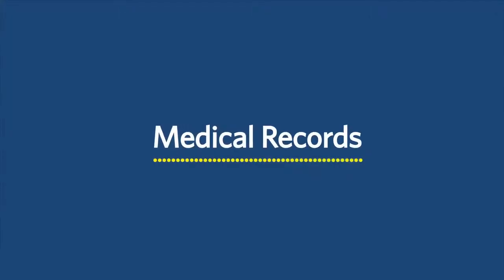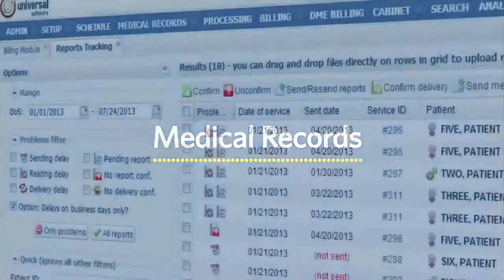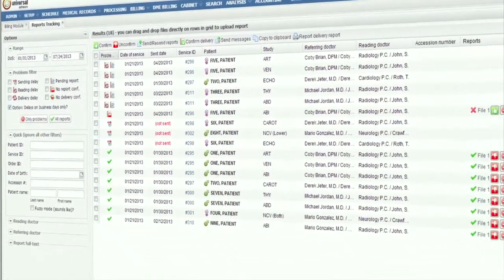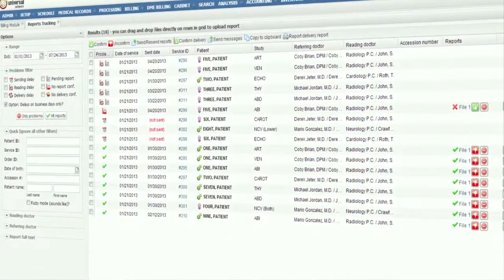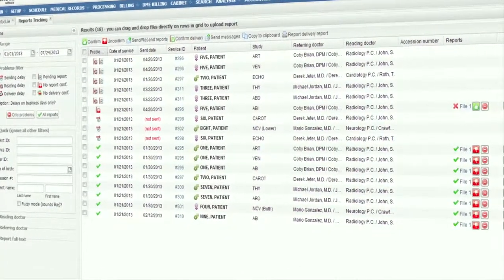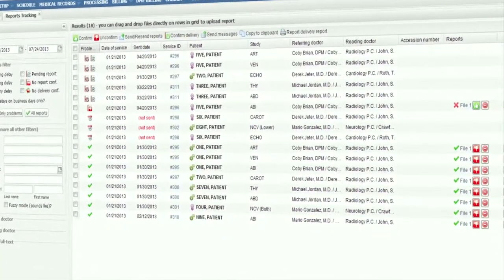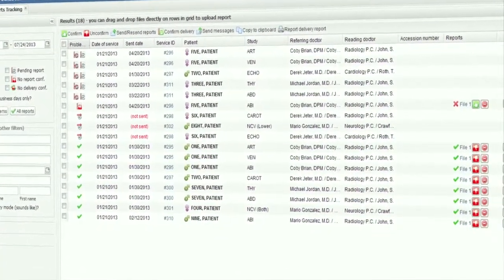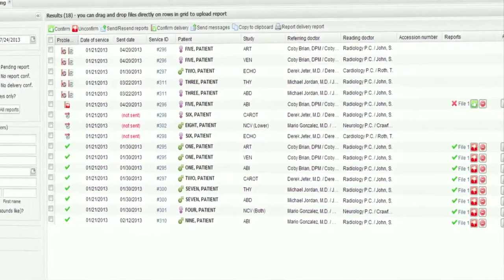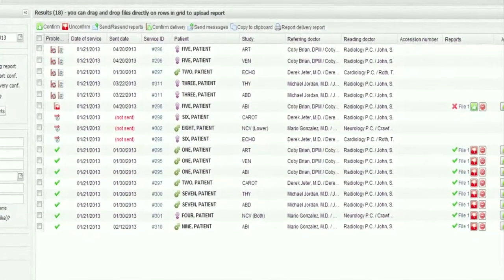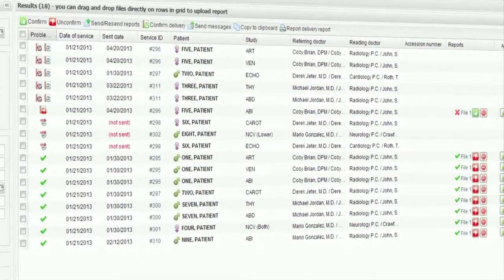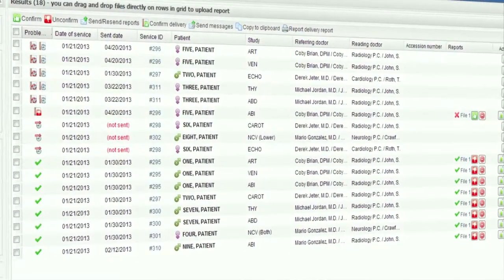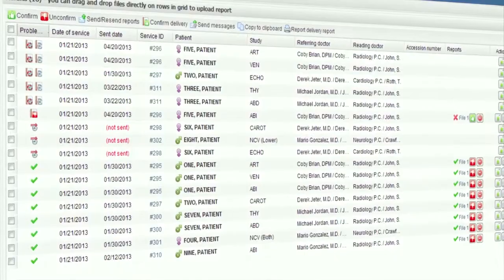Here the system shows you which reports are delayed and why, and can be set to automatically fax reports to referring doctors who are not EMSO users. Once the report has been delivered by email, EMSO automatically uploads it to the appropriate patient.